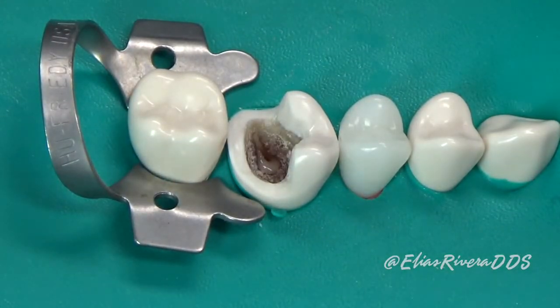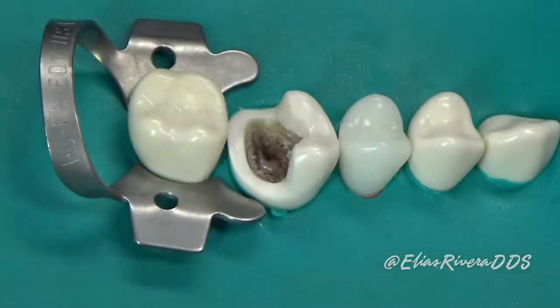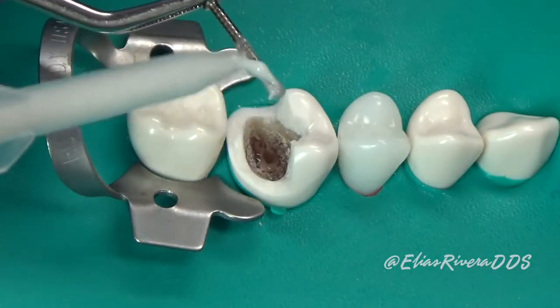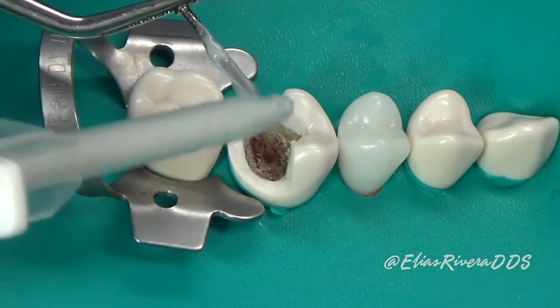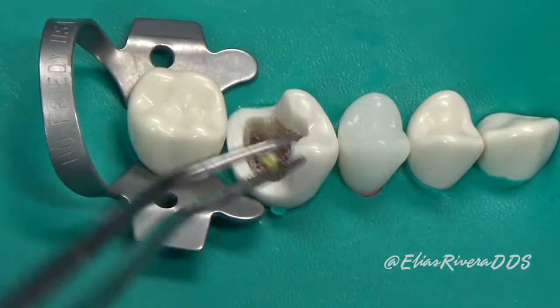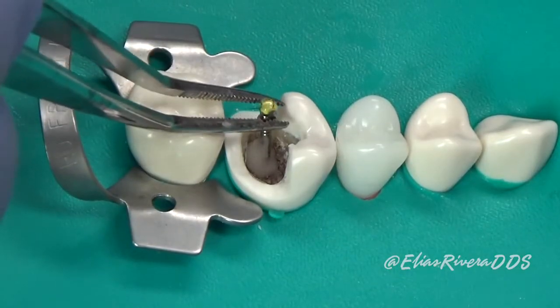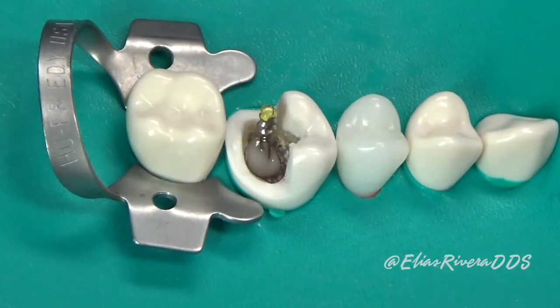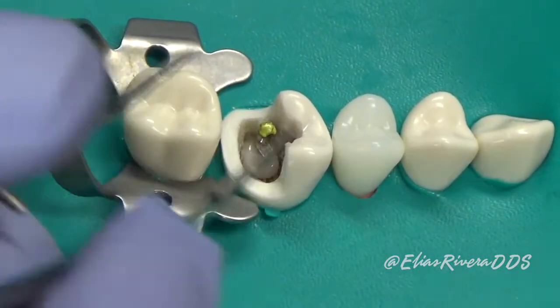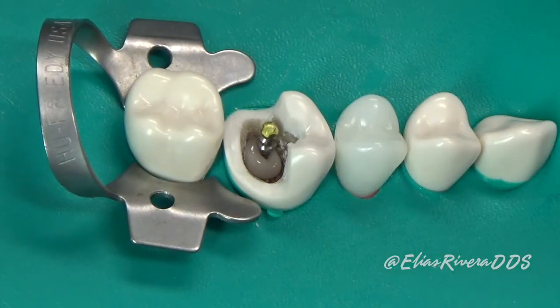Now it's time to cement our ParaPro post. For this we're going to use the same cement — we're going to place it on the post and insert it inside the canal with light pressure. We're going to make sure we achieve our working distance, and then we're going to go ahead and remove all the excess cement.